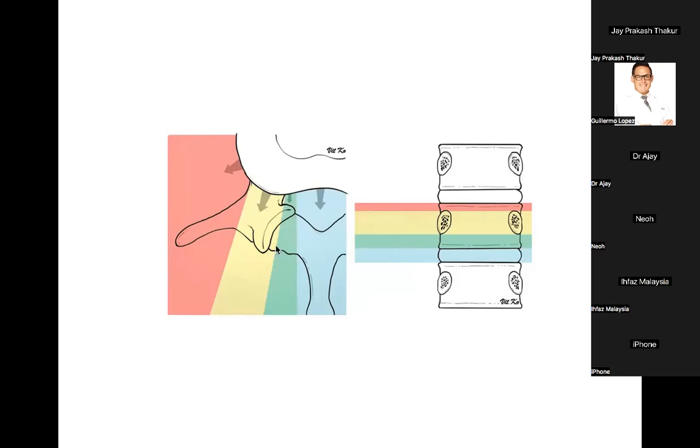Okay, so now we also discuss the different types of herniations. Don't send it on the chat box, I need to open it again and again. You can just unmute yourself and tell me. So this is basically the type of herniation. Our entry, the distance from the midline, our angulation, everything will depend on the type of herniation and which side it is. Whether it is a central herniation, a paracentral herniation, which is also called subarticular, or a foraminal herniation, or an extraforaminal herniation. Depending on that, we have to select our entry point, angulation, and distance from the midline.